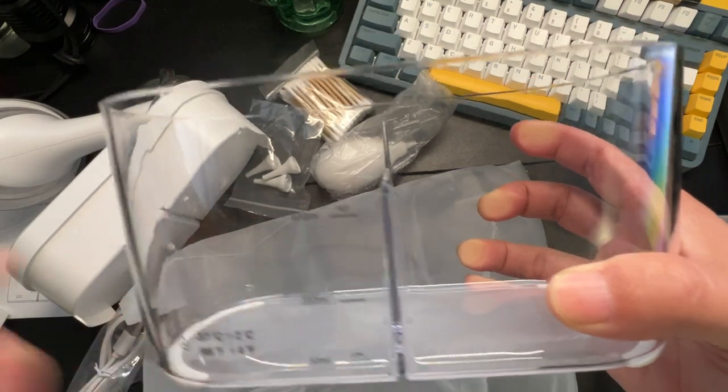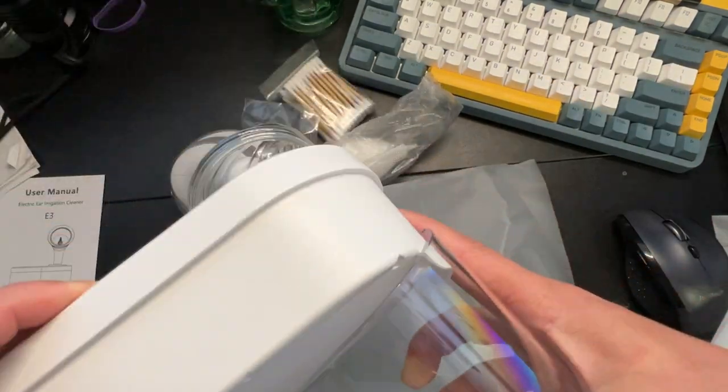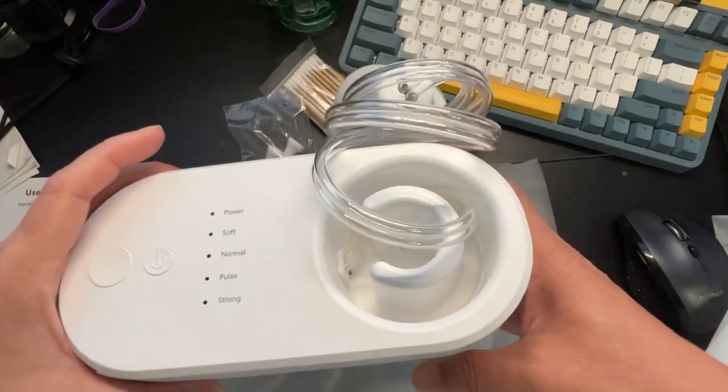As you can see, it fills up with water and you let the thing do its work.